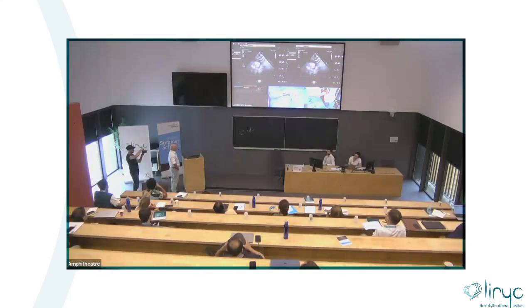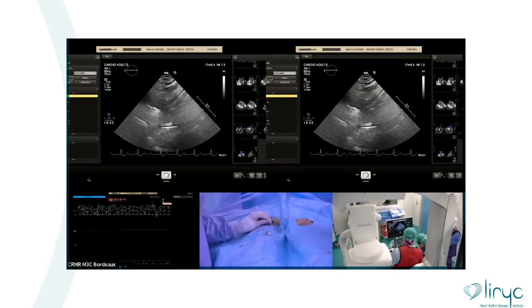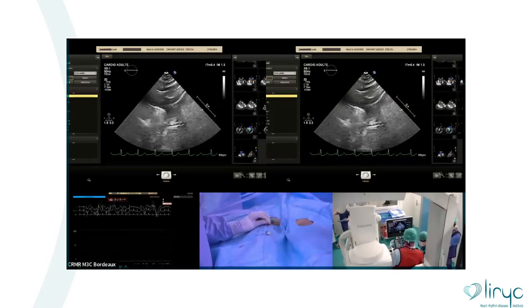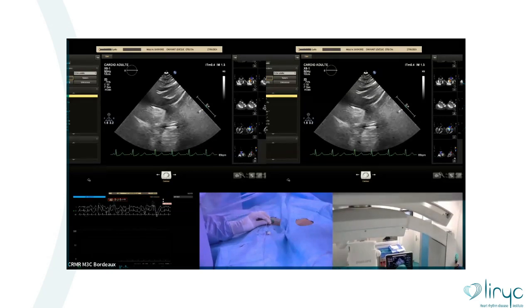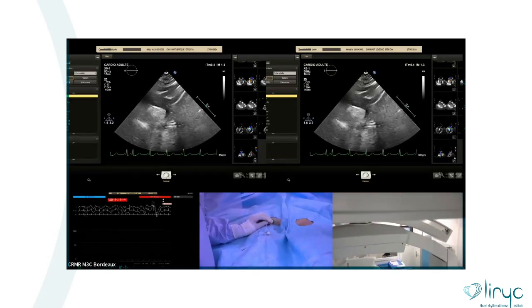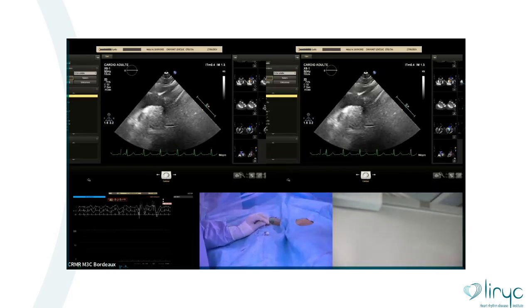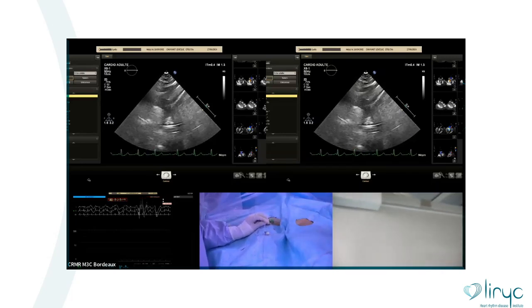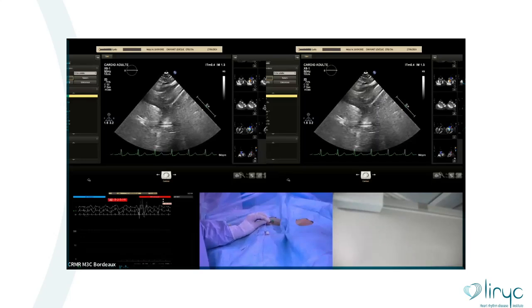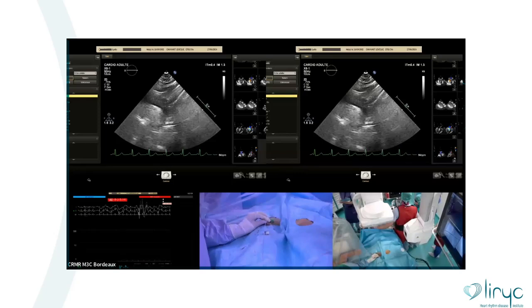The trick will be to have the wire and catheter go together, to have the left-sided disc nicely adjacent to the septum. Hold the wire and advance the catheter. We make a marker on the pigtail to be sure that we will go on the ascending aorta. Now you can see the wire on the suprasternal view in the aortic arch, and we are advancing the catheter over the wire.